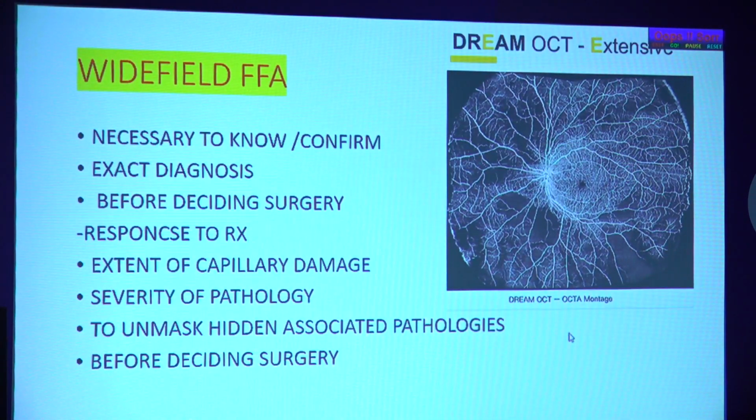And now this is a picture of OCT angiography. Wide field OCT angiographies are now available in the market. One can see this, even though the cost is high, but obviously you can try anytime.